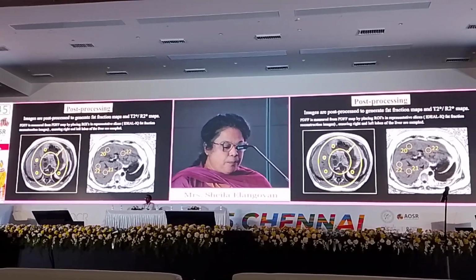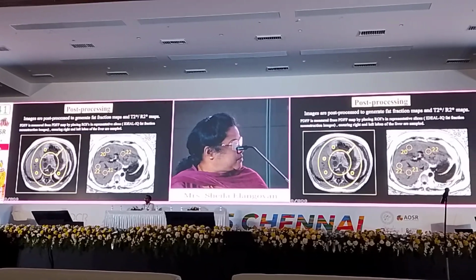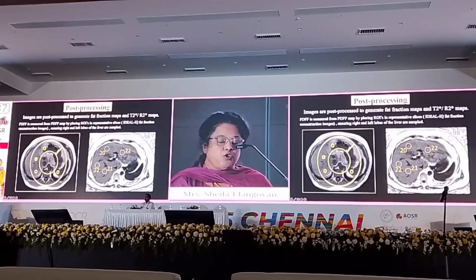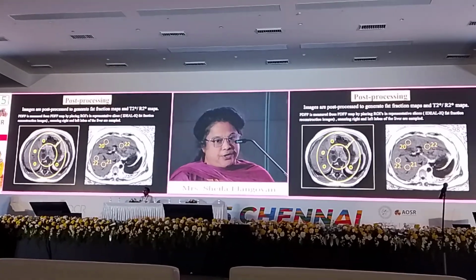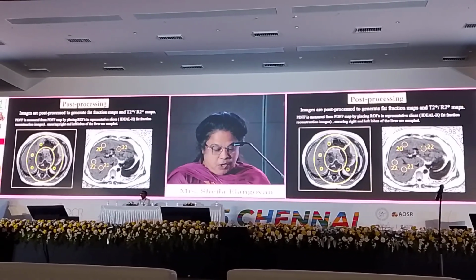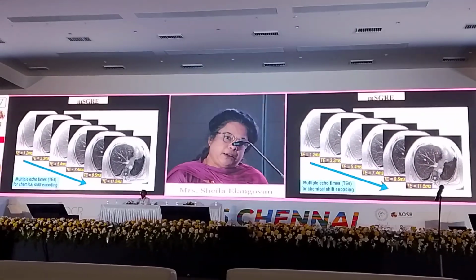And you also place one in the second image. You can see there's one placed in the subcutaneous fat. So there the value should be closer to 80 to 100. So this is because you need a scaling factor for comparison. Okay, so this is how your calculation has to be, and you will be taking the average.